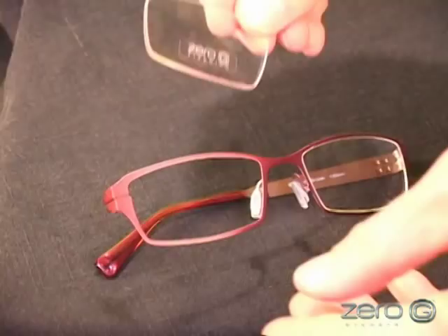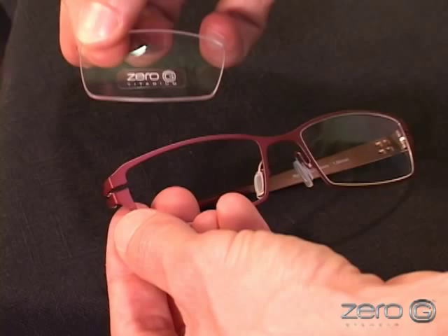Replace the demo lens with a prescription lens, ensuring the frame is firmly entrenched in the prescription lens groove.